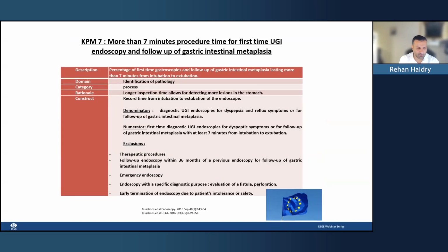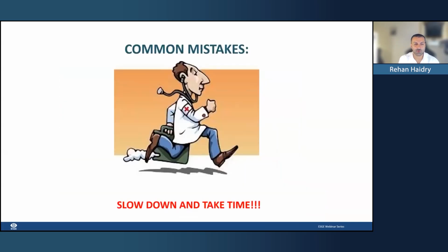God, so many lectures on inspection time in the colonoscopy. It's so boring. Why don't we do it in the upper GI tract? Really, really important. A common mistake: slow down, take your time.